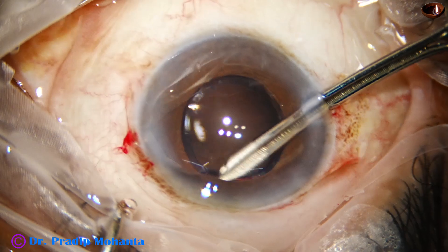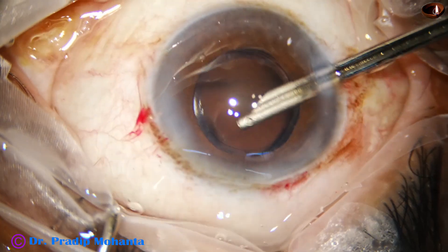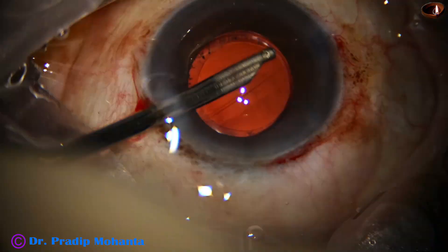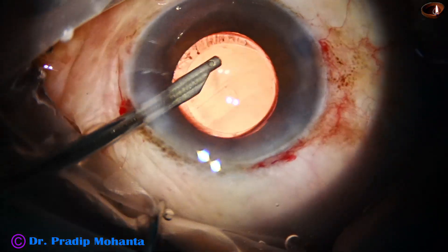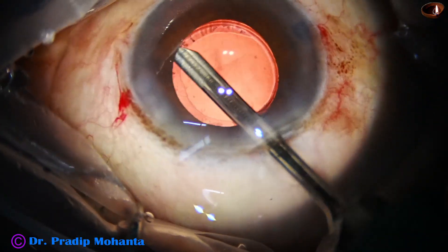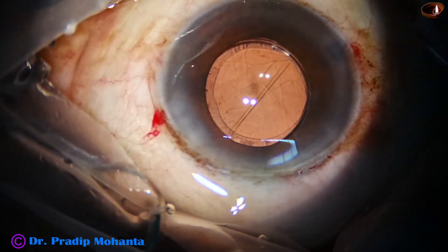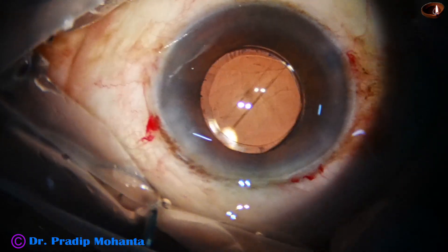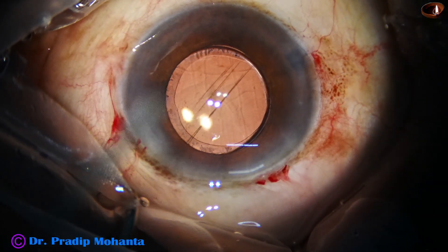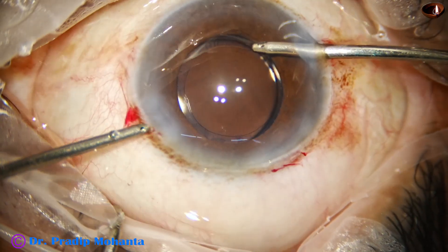I take help of the side ports and remove the cortex. I thought there was hardly any cortex, but a lot of cortex was left under the iris. Now you can see that there is hardly any cortex remaining, and the rhexis is nicely overlapping the optic of the intraocular lens — this is very good. It helps in centration of the intraocular lens, and the lens does not tilt if it is overlapped by the anterior capsular rim all around.